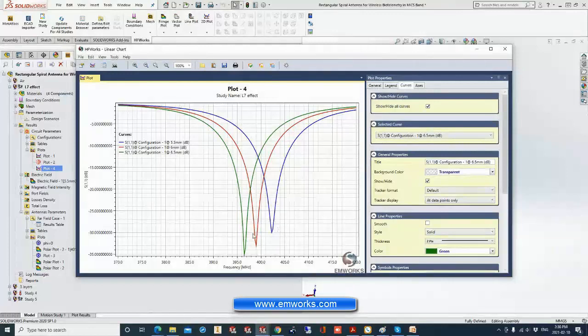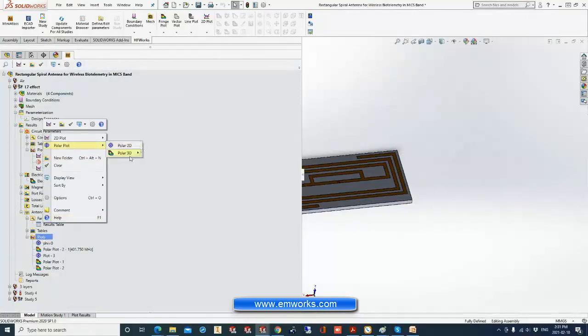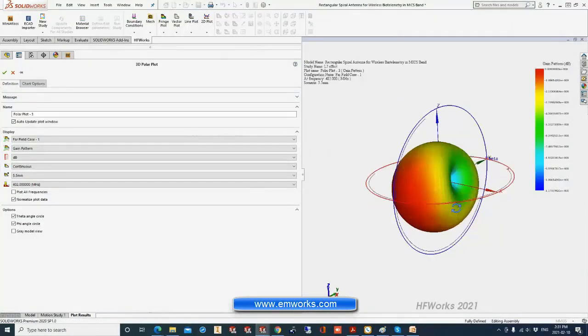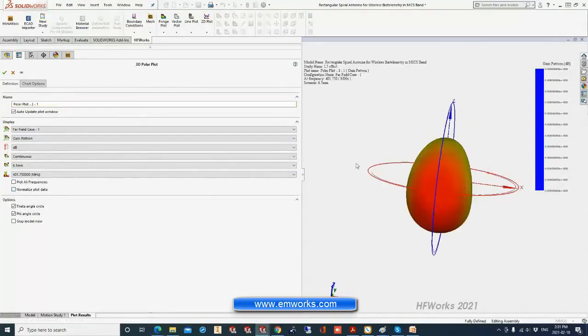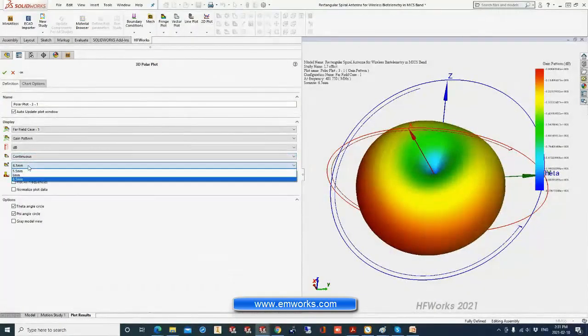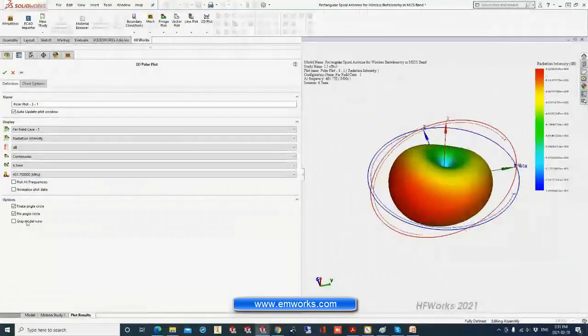It's very easy to use. No need to recreate the geometry or to redefine everything from scratch. You just use the parametric study. Same thing for the far field parameter. You can come here to make a polar plot, and you select your frequency, you select your scenario, and you can check any parameter related to a given scenario or a given frequency. So we have the frequencies, scenarios, and you can plot any quantity.